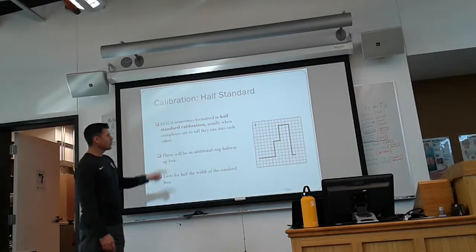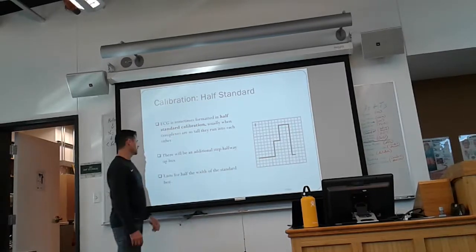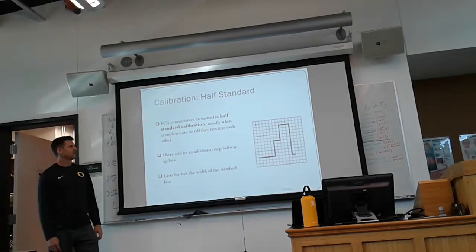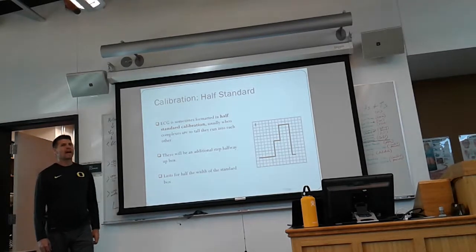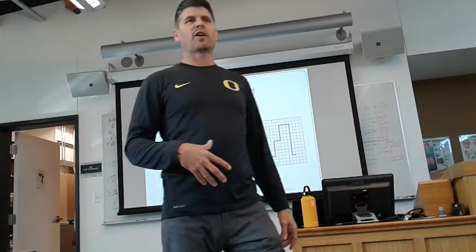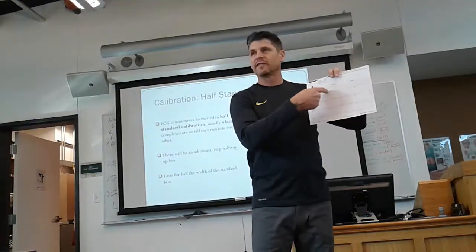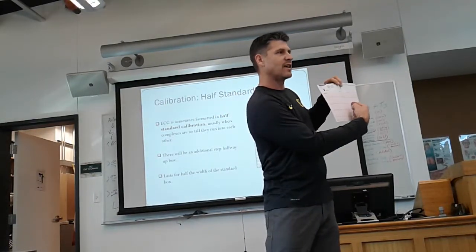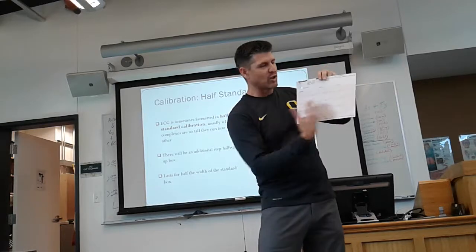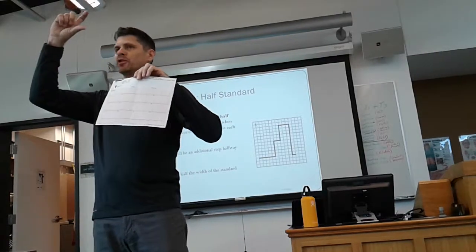So in this case, we have a half standard calibration. There will be this little half step in there, and that half step is half the width of the standard box. In some people, maybe because they don't have a whole lot of impedance, or depending on what is electrically going on with the heart, we sometimes look at our EKG and have QRS complexes from the second line down running into the QRS complexes on the upper line or the bottom line. And so when we're looking at that, we see a whole bunch of stuff, but we can't actually see where the QRS complexes start and end, amplitude-wise.